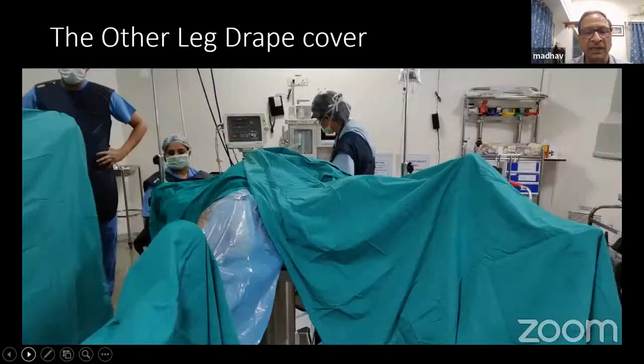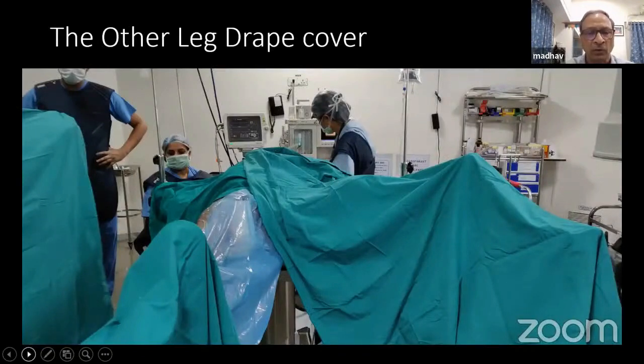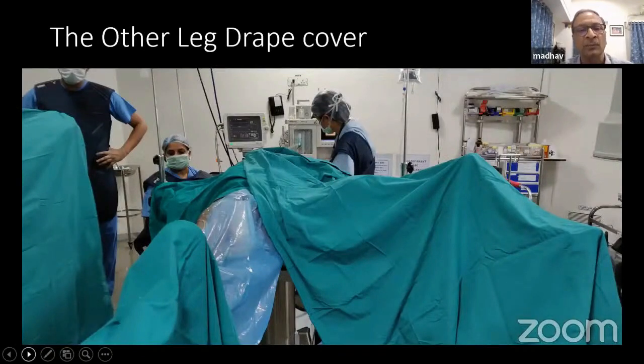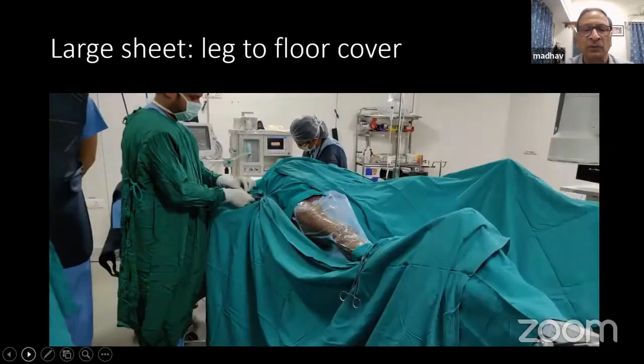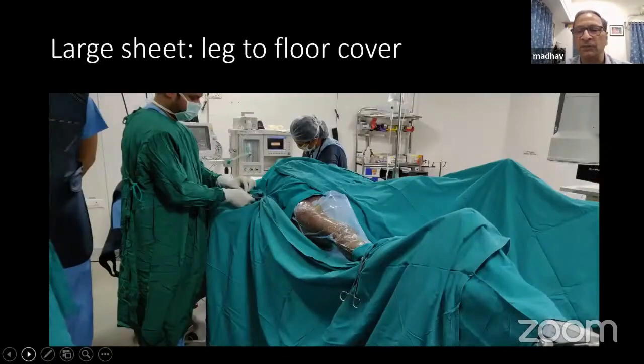For a lateral view, the C-arm tube has to go below the hip and come up on the other side. These are slides of how you drape — we will come to the video shortly.